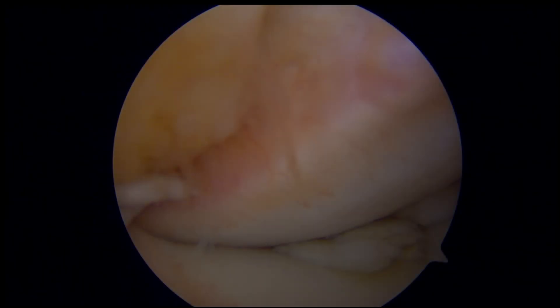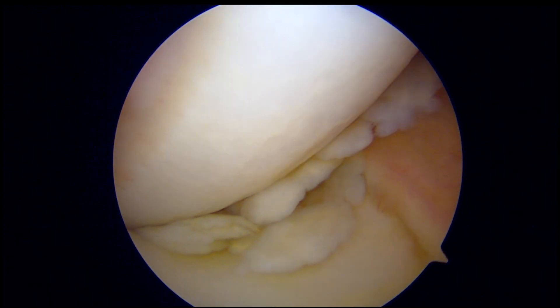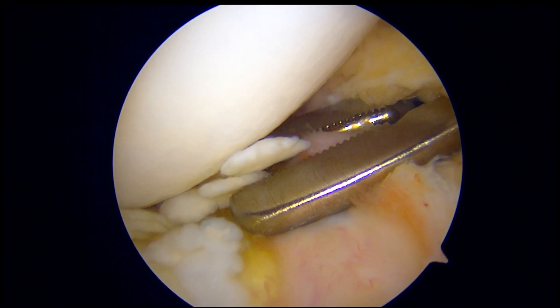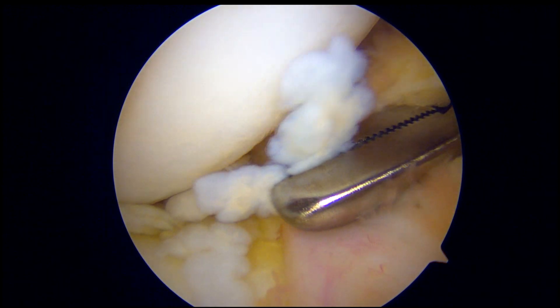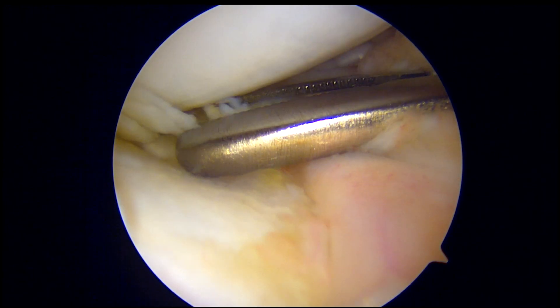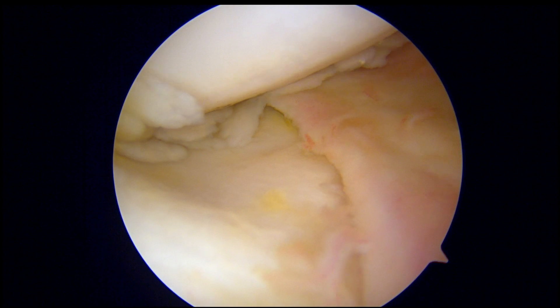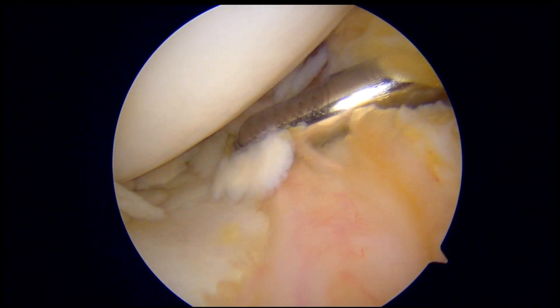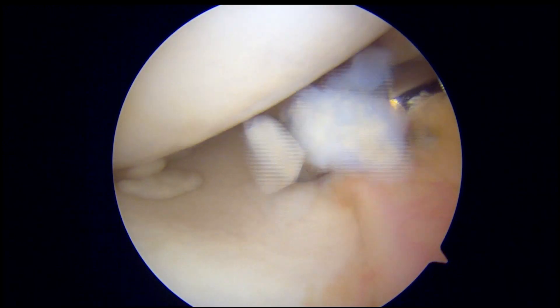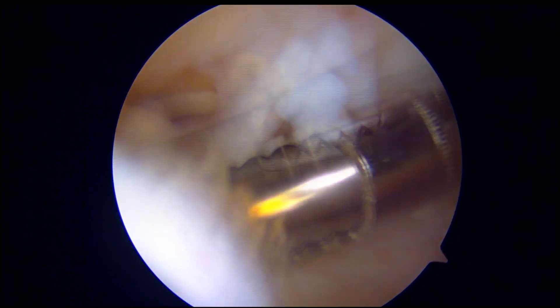This patient underwent a knee arthroscopy, and upon introduction of the arthroscope into the knee, you can see multiple loose bodies predominantly composed of cartilage. An arthroscopic grasper is utilized to remove these loose bodies, and then an arthroscopic shaver is also introduced to assist with removing the arthroscopic debris.